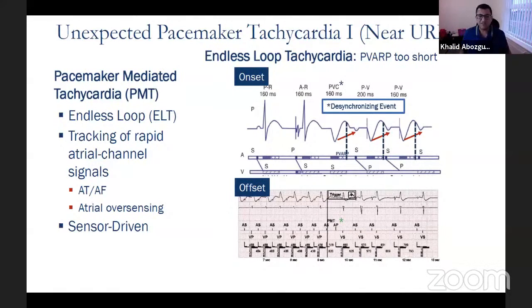I think if you have only a single lead, for example, VVI, and you want to upgrade it to an ICD, there is an argument to just put an ICD lead in. But obviously, you have to take into account the duration of the pacemaker, how long it's been in, the comorbidity of the patient, the location of the lead, and so on and so on. So that's my first comment.